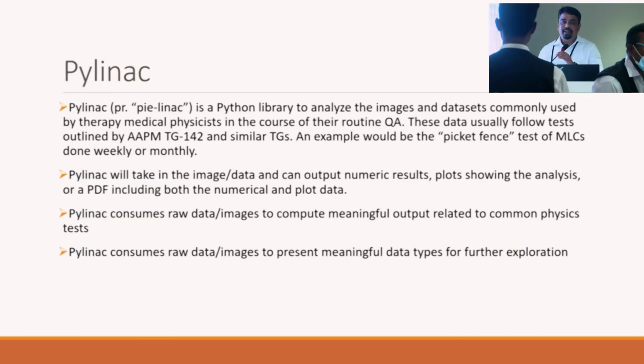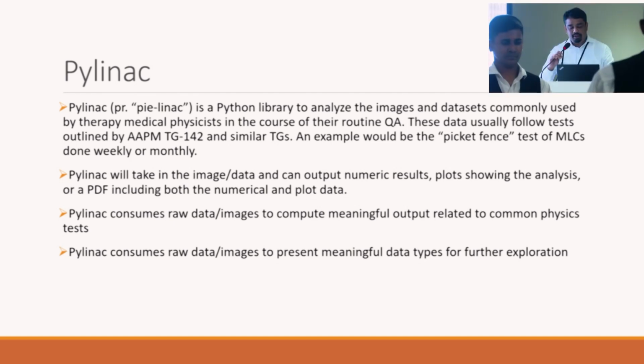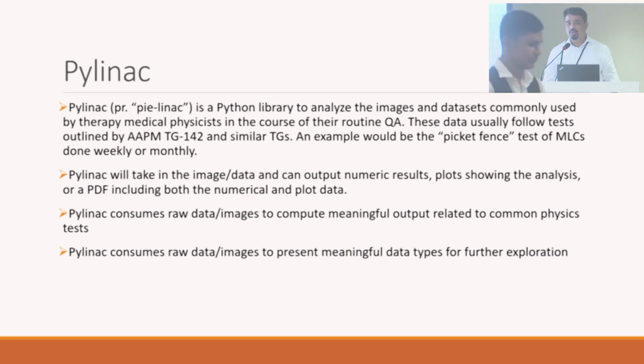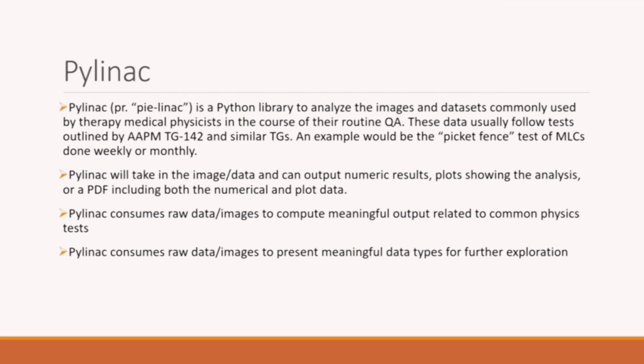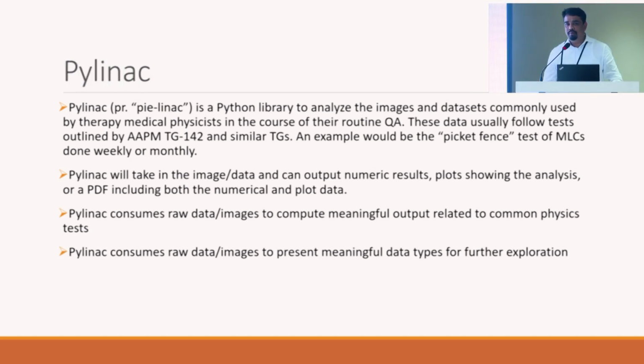There are a lot of commercially available software packages, but I just want to give a single, simple example. I don't want to talk about automation for an hour, but I want to show how you can use automation in your clinical work. There are open sources available like Pylinac and PyDicom, which are really useful. If you're able to map your clinical workflow, we can easily automate a lot of manual work in your clinical process.